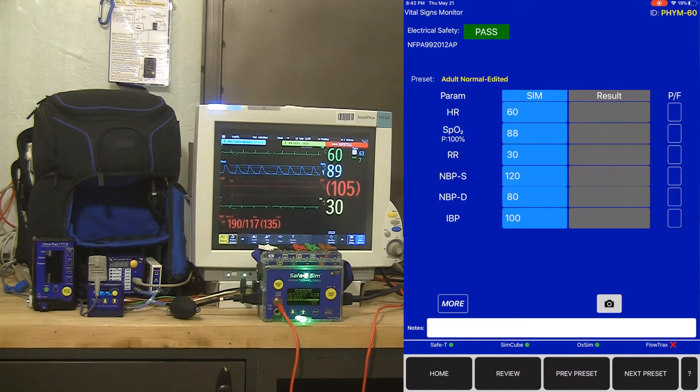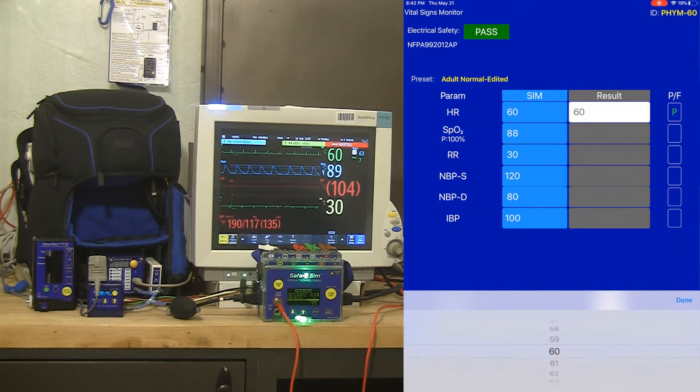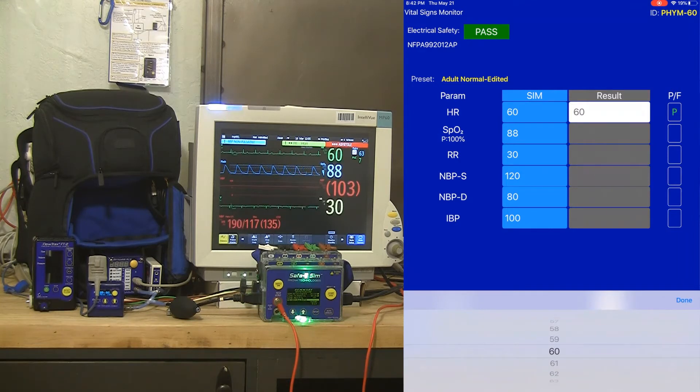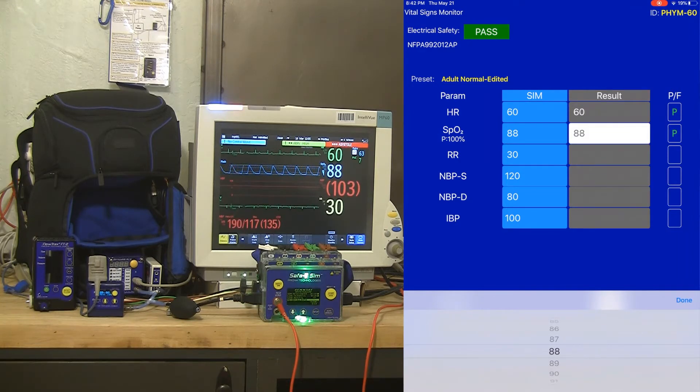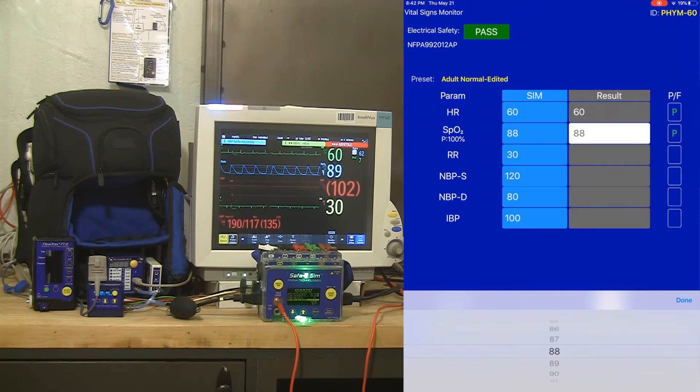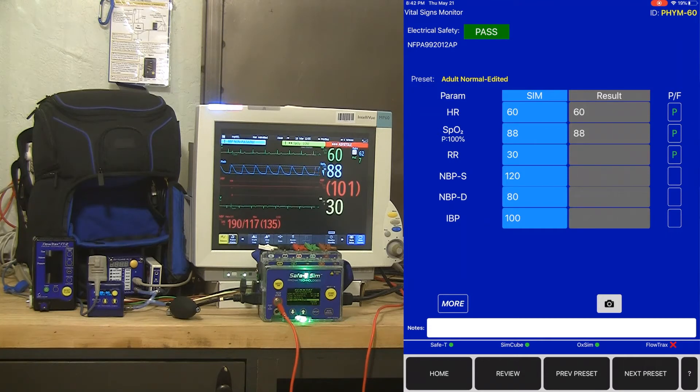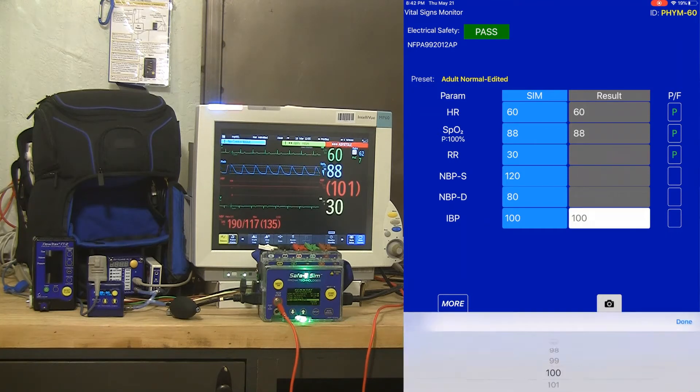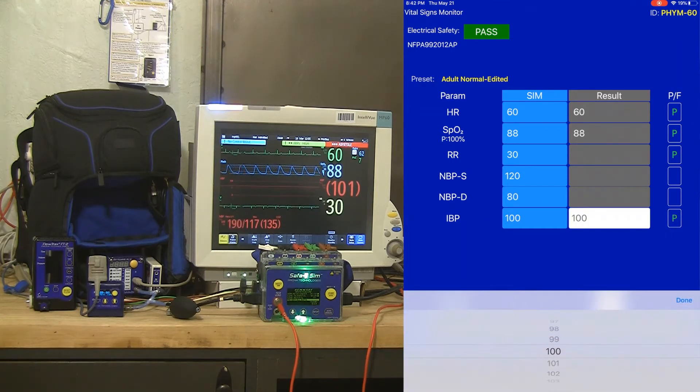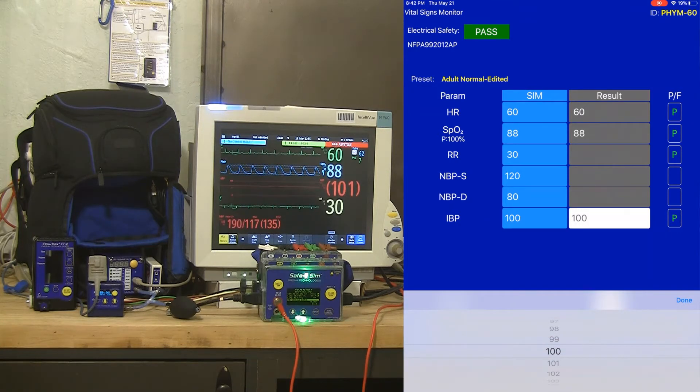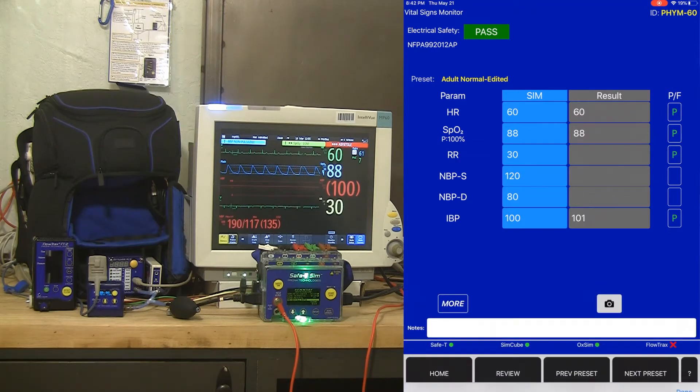So now I've got a result of 60 for my ECG heart rate, 88 for my SPO2. My resp rate is 30. You don't have to put a result in, you can just tap the pass button, but it's very easy to put the result in by tapping on the result box because we land on the target value and let you scroll quickly to the result.